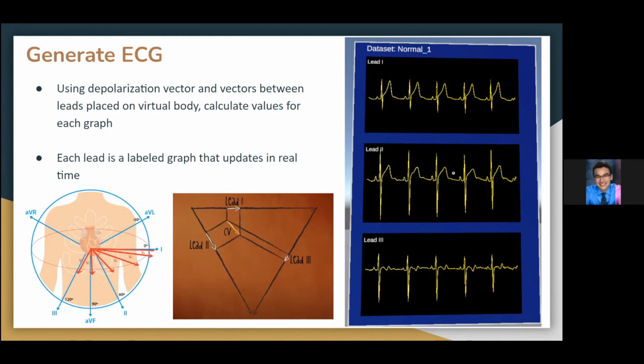As we'll see when we run our demo soon, these graphs are moving in real time. They're shifting from right to left, and they're actively updating. So if you pick up one of the stickies and move it, then all of the graphs will change.